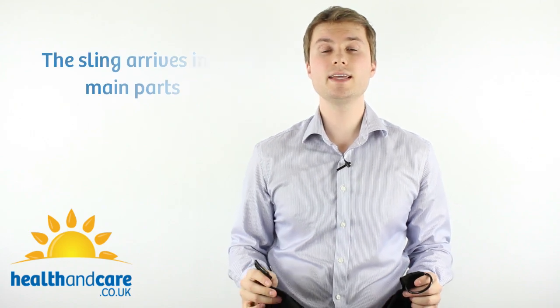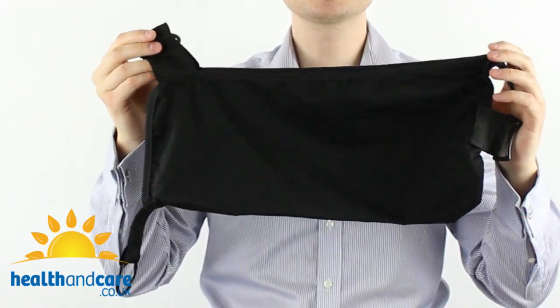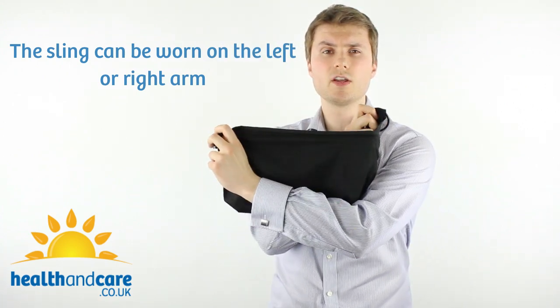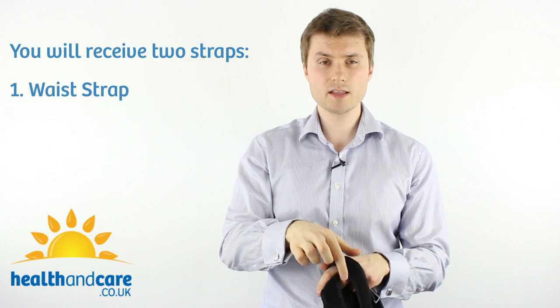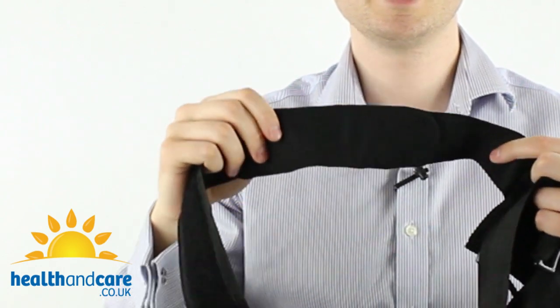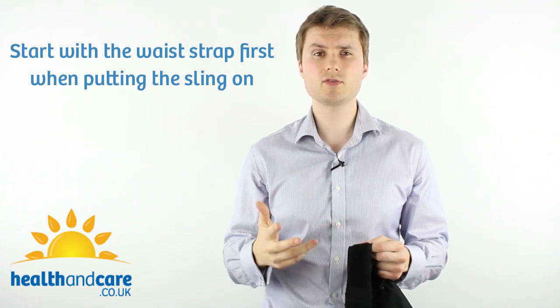When the sling arrives it comes in three main parts. The first is the envelope — this is where your arm rests when wearing the sling. I'm showing you how to put it on the left arm today, but if you're putting it on your right arm simply switch the envelope round and follow the same instructions. The other parts are the straps: the waist strap, which has velcro on one side and is smooth on the other, and the shoulder strap, which you can identify by the pad on it — the neck or shoulder pad that adds comfort. The best approach is to start with the waist strap first, then work on the shoulder strap.